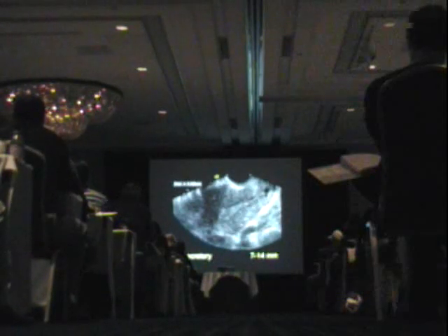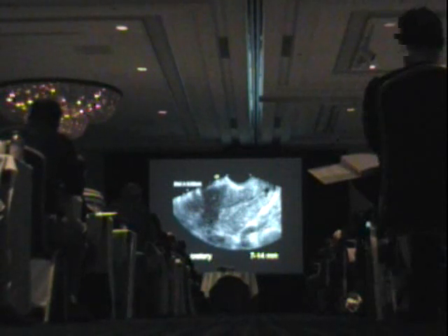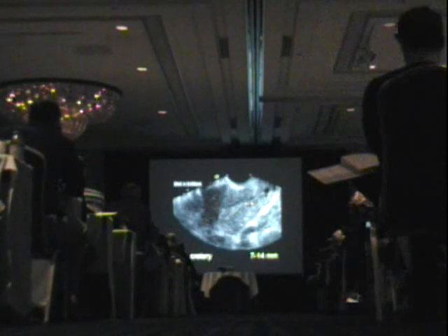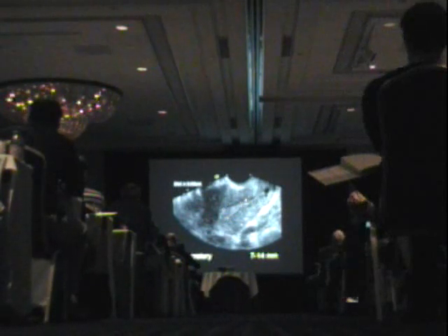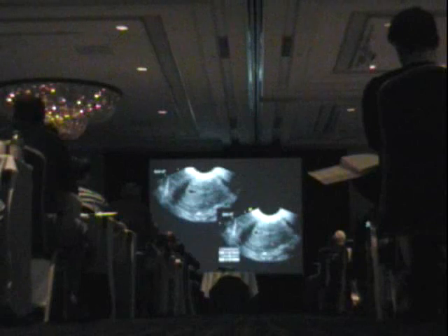Following ovulation in the second half of the cycle with progesterone effects, we're into the secretory phase. This is when the lining becomes homogeneously echogenic and typically is thicker than 7 millimeters and up to 14 millimeters prior to the onset of menses. And in this patient, we see about a 10 millimeter thickness.